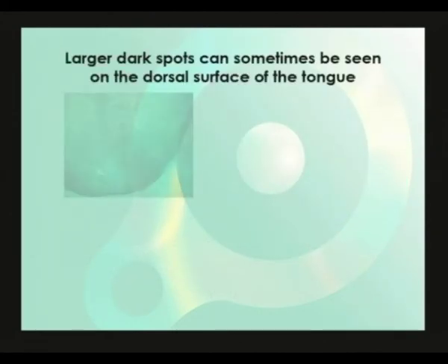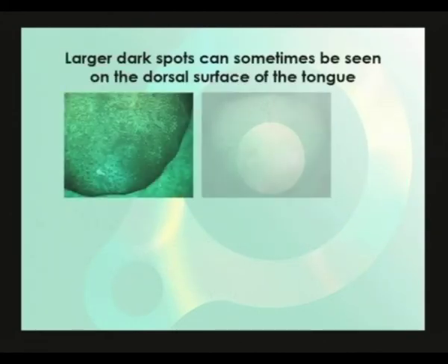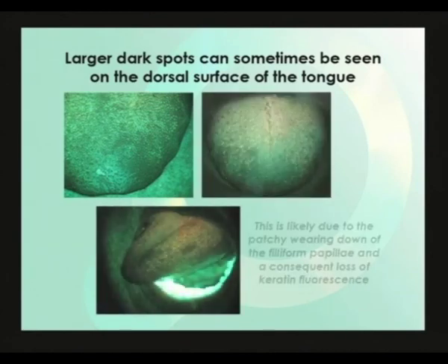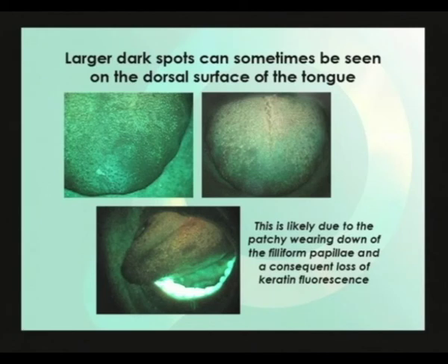Larger dark spots can sometimes be seen on the dorsal surface of the tongue. This is likely due to the patchy wearing down of the filiform papilla from use of the tongue, resulting in a dark patch due to the loss of keratin fluorescence from the filiform papilla.